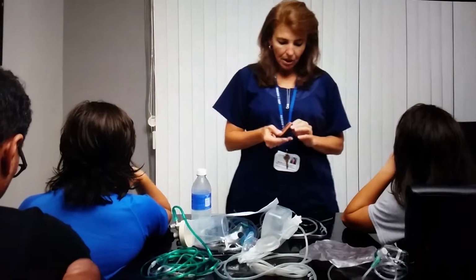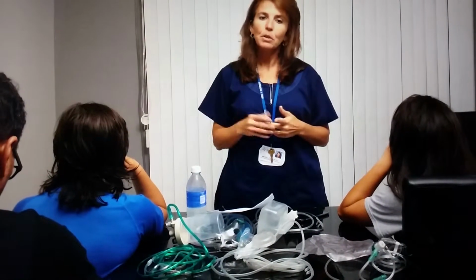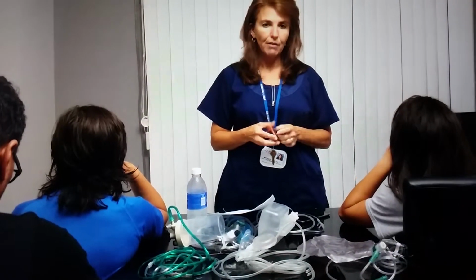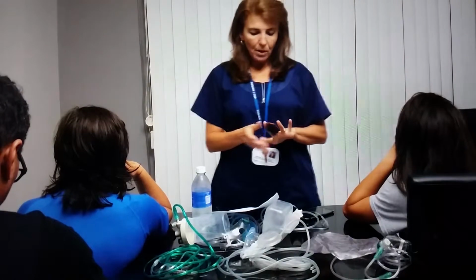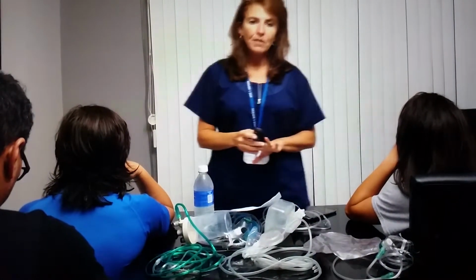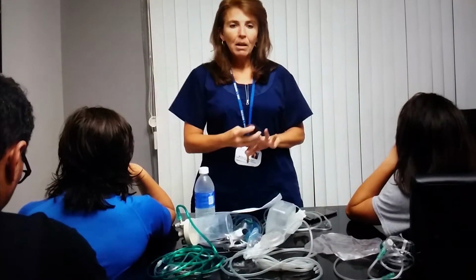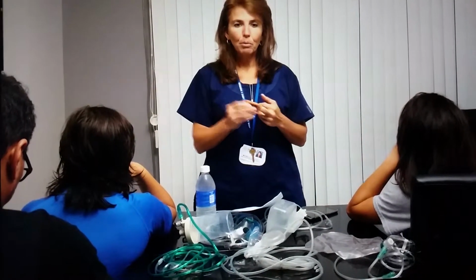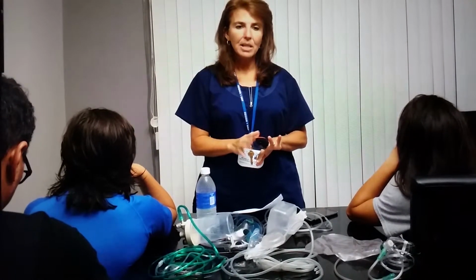We tell our staff to actually use the non-dominant hand, because if you use your dominant hand, you get a lot of artifact. You usually have the best pulse in your middle finger. So once you apply the oximeter, we want to make sure that we're waiting at least 15 to 30 seconds so that we can have an accurate reading. Far too often we see staff put the probe on the finger and then take the first reading they see, but we would like the reading to stabilize.